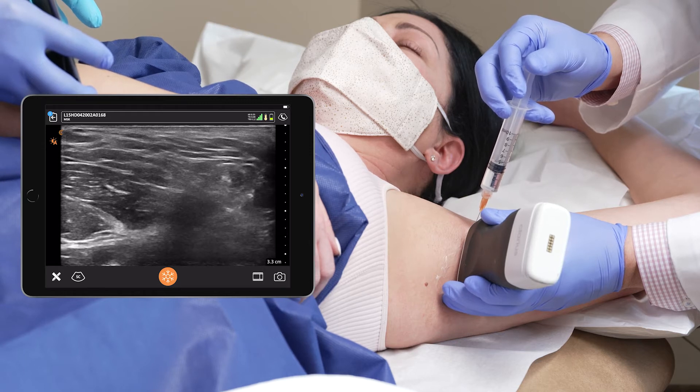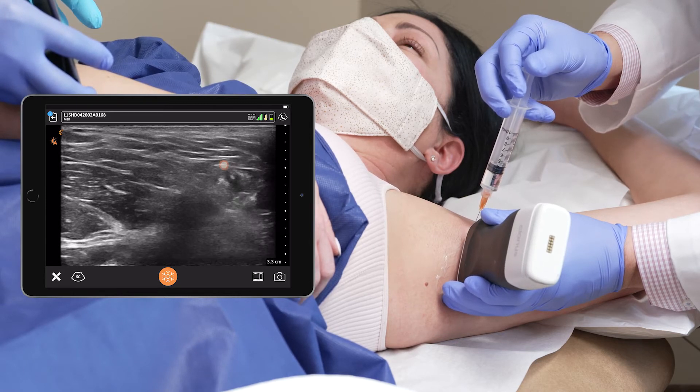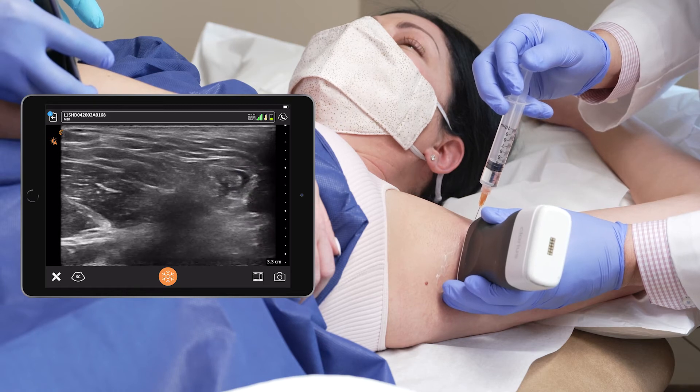Injecting by the ulnar nerve. Anything going down your hand? No, it's going down my arm though. In the spot of your pain? Mhm.